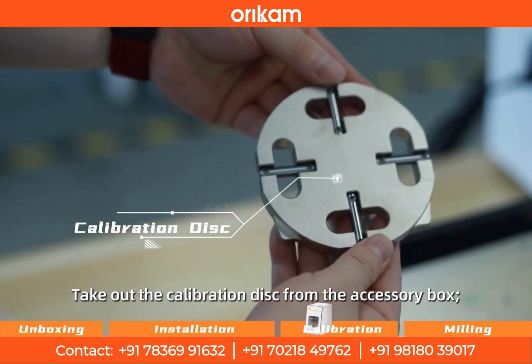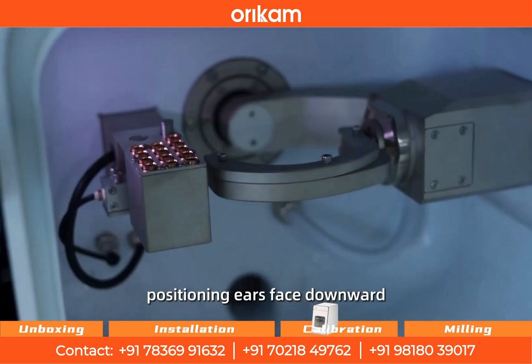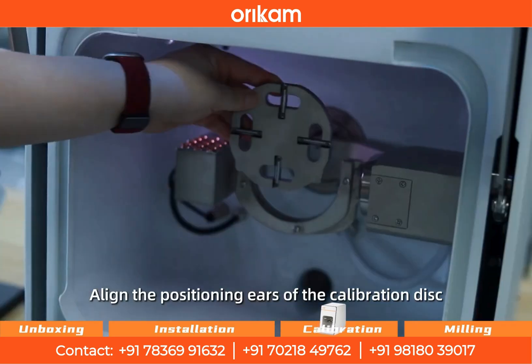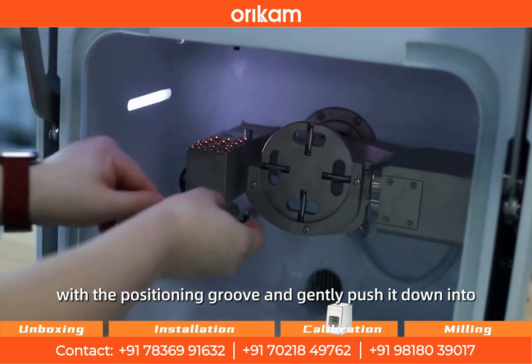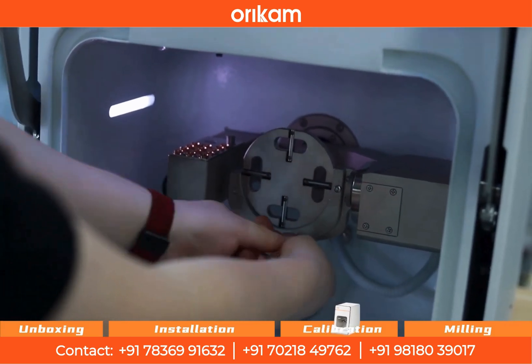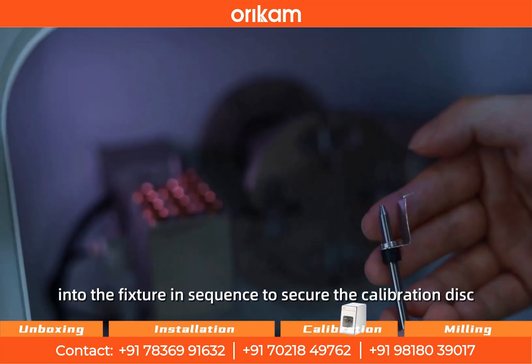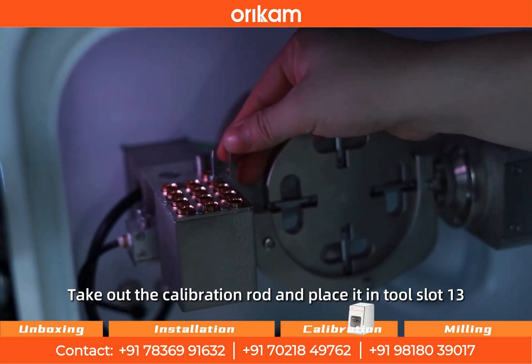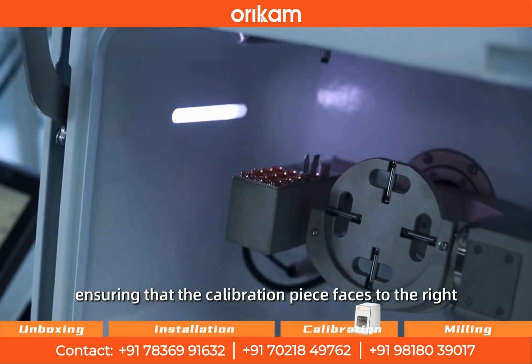Take out the calibration disk from the accessory box. Ensure the calibration disk's positioning ears face downward and align with the bottom side of the fixture. Align the positioning ears with the positioning groove and gently push it down into the fixture to make the positioning ears fit snugly into the groove. Then tighten the three hexagonal socket head bolts into the fixture in sequence to secure the calibration disk. Take out the calibration rod and place it in tool slot 13, ensuring that the calibration piece faces to the right.